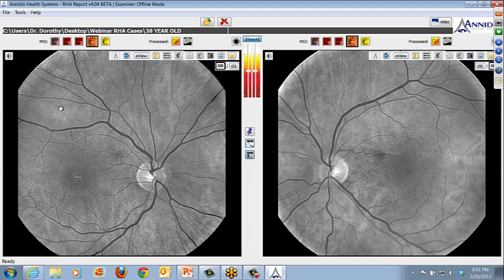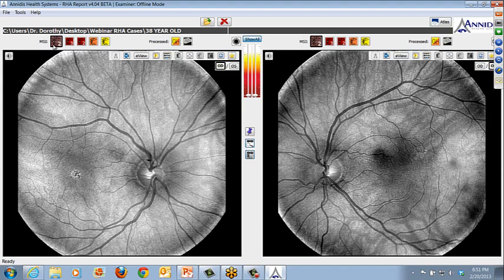Okay, so this is a 38-year-old Caucasian male, no other family history of retinal degenerations or dystrophies, heavy smoker, very light blue eyes. Father went blind from, quote, glaucoma, you know, where you can't see in the center of your vision. I think we've all heard that one before. Overweight, poor nutrition by self-description. And this is his screening RHA that he had in my clinic.